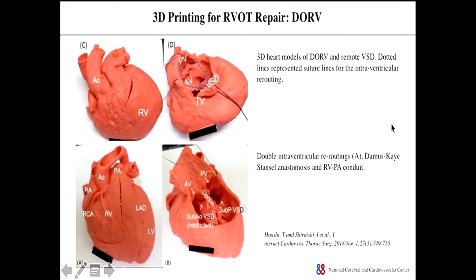This is a detail of the simulation. This is the case of DORV with remote VSD. We did the surgical simulation by using this model. We were able to design the internal conduit of this case.